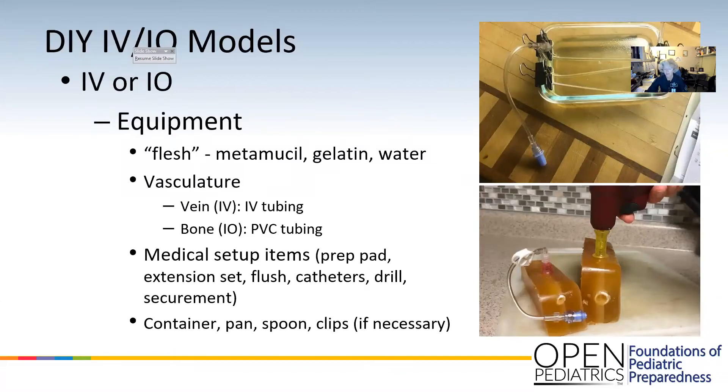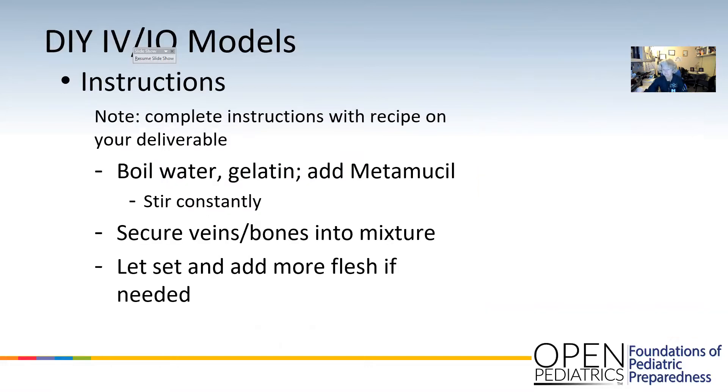You just have all your things set up — your clips — so you can keep the IV tubing within however deep you want it within each model block. The recipe is in another video. It's basically water and then gelatin and Metamucil. The Metamucil is what colors it, so you can add more and then the texture is a little bit darker.